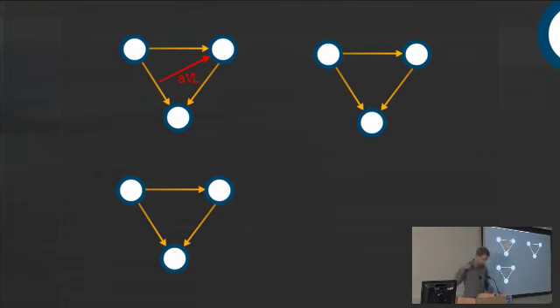And that means, so you take the average of there and there, you're somewhere here, aren't you? You're travelling up towards the left shoulder. And that's why aVL is looking at minus 30 degrees. For aVF, you're looking at the average of these two. So you're here, basically, aren't you? That's effectively what you're looking at.